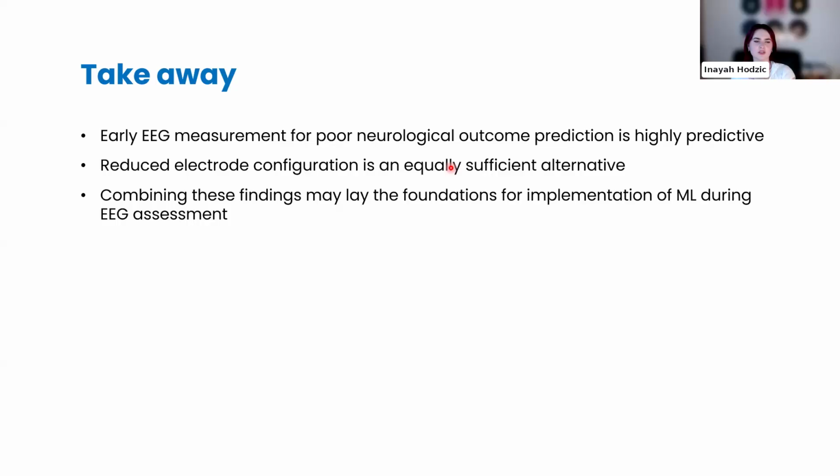Yeah. So to answer your first question, at our medical center, continuous EEG is used as standard practice. We have a large center with a lot of capacity, which is obviously part of it. But EEG is started as early as possible, and I think most are started within the 12-hour mark and perhaps even within 6 hours of arrival. So we do that.